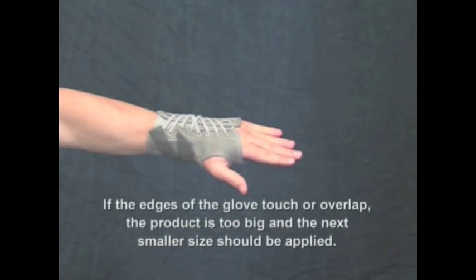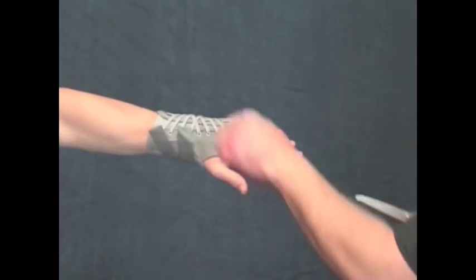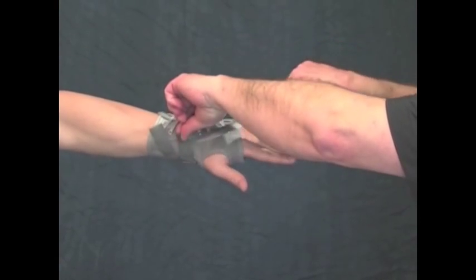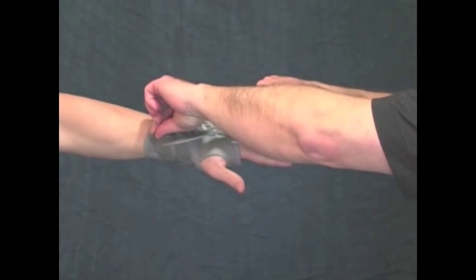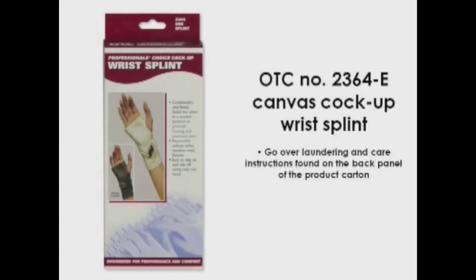If the edges of the glove touch or overlap, the product is too big and the next smaller size should be applied. Once the splint has been snugly tightened, excess hook material on the closure strap can be easily trimmed away with scissors. Instruct the patient how to do this on his own after purchasing the product. Finally, be sure to go over the laundering and care instructions that are found on the back panel of the product carton.